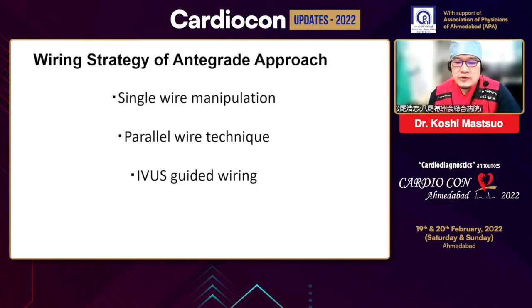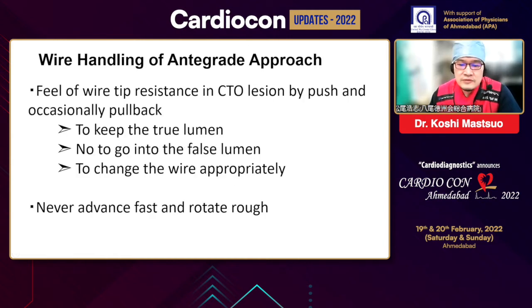When you start wiring, firstly single wire manipulation, and secondly parallel wire technique. And sometimes we need IVUS guided wiring. I want to talk about handling the wire.